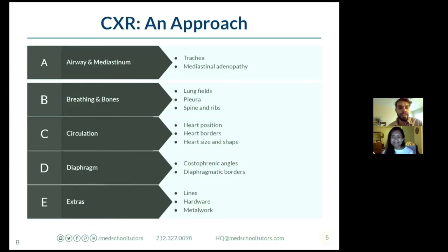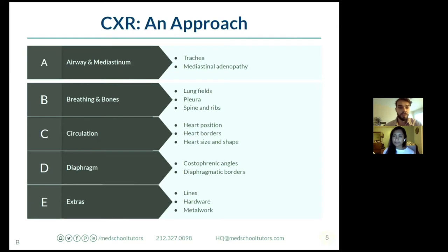I think it's always important when going through x-rays to have an approach. You don't have all the time to go through a full assessment of the x-ray, so you want to focus on what's really important. It's nice to have something to fall back on when stress is high. A, B, C, D, E is something that we can all remember.